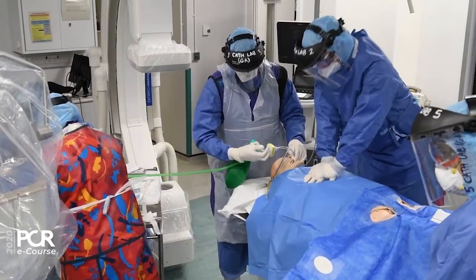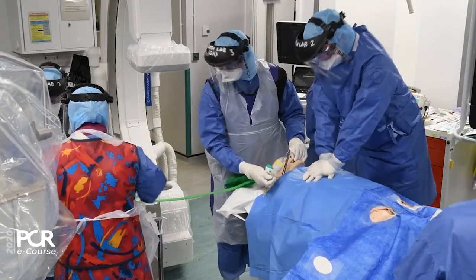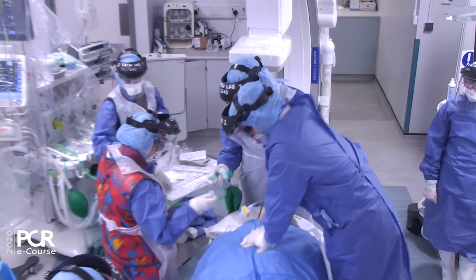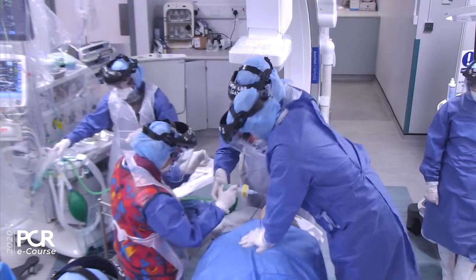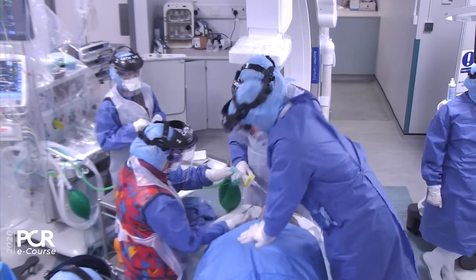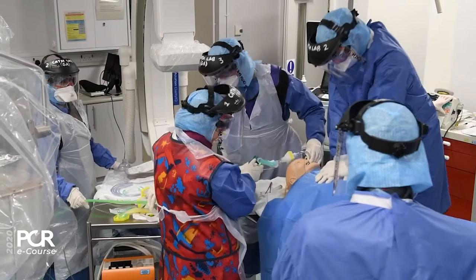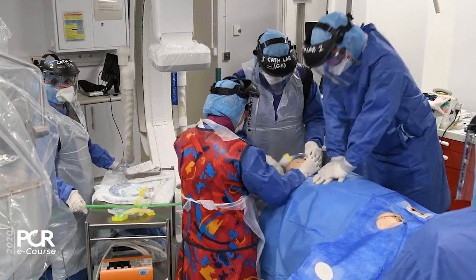What's the timing? 30 minutes. 2 minutes over. Another 2 minutes to go on. We carry on CPR. We can't shock at the moment. Carry on CPR. Okay, are you happy for me to shock him again? Let's check if anyone's tired first. Callum, tell me if you're tired. I'm good.